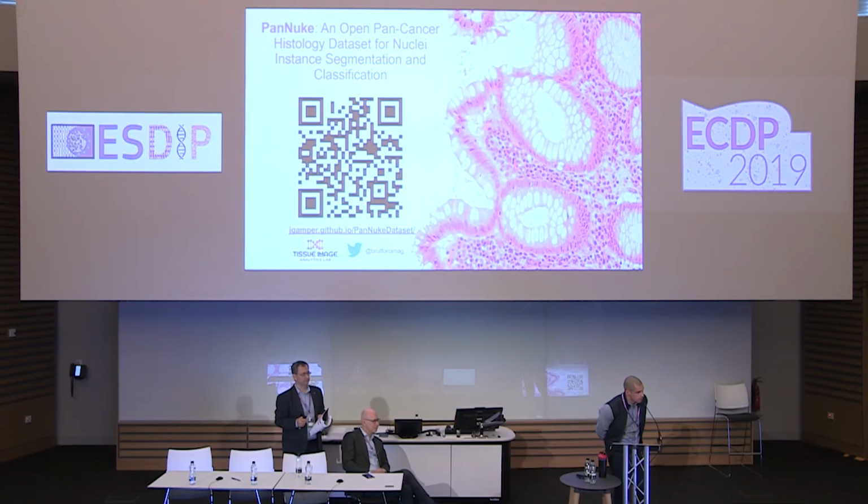But that means the model will work on the data set, right? Yeah. And so, I mean, it's PanNuke. So yeah, the view is to have a model that works on all data. Yeah. I guess, how do you see getting there? That's really what the question is. So the point at which we stop is when we're satisfied of having enough data that we can learn a good enough model to classify nuclei in any of these tissues sufficiently.